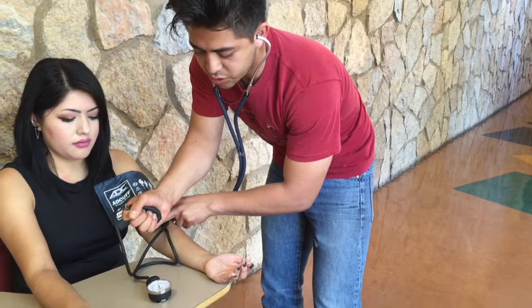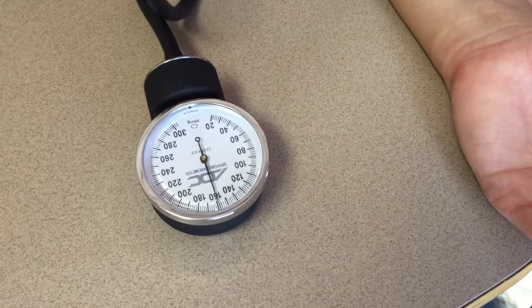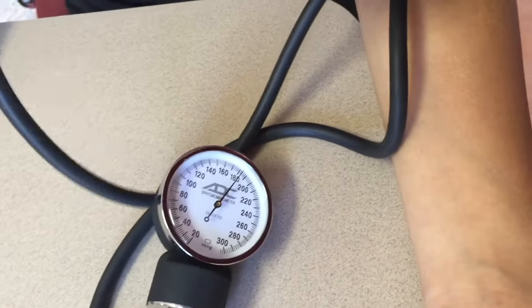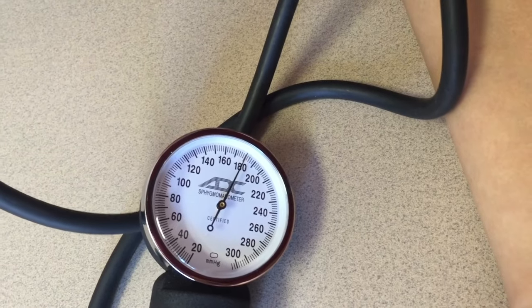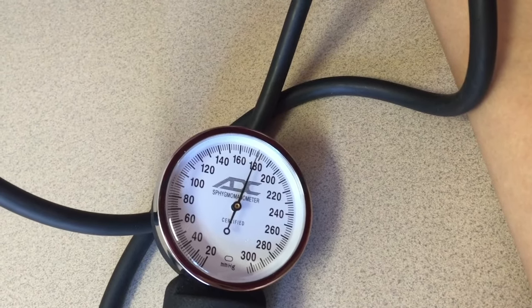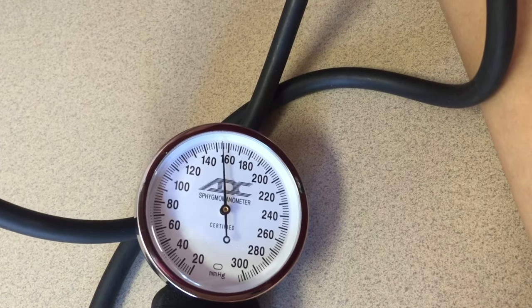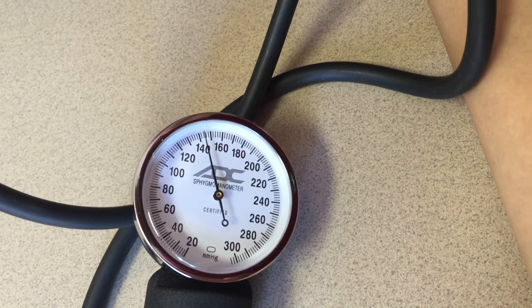As you increase the pressure, you want to make sure that you only go approximately 200 millimeters of mercury and release approximately 2 to 5 millimeters of mercury per second. You will be listening for the Korotkoff sounds. The first one will be your systolic and your last one will be your diastolic.